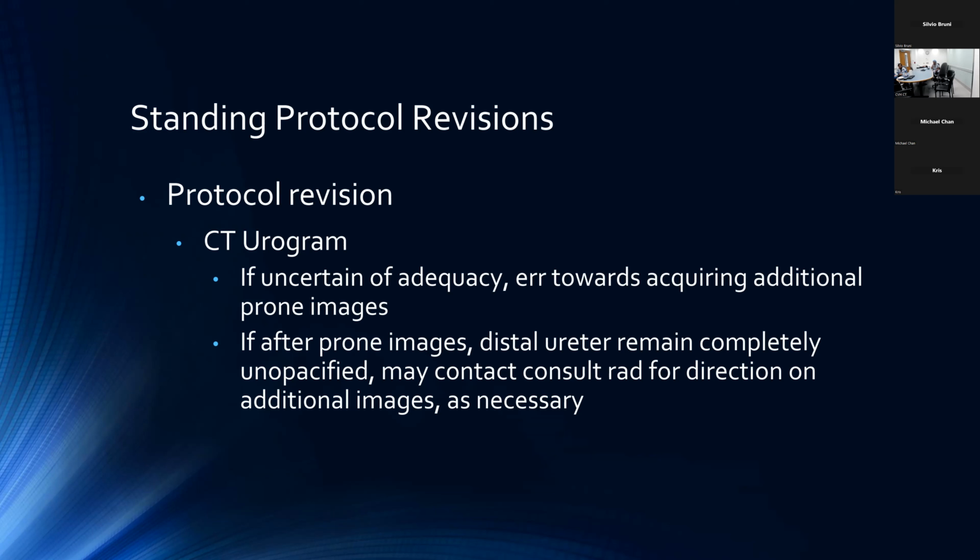So with all that said, let's go over a couple of examples just to illustrate what is considered generally passable and what I would say would warrant repeat prone imaging.